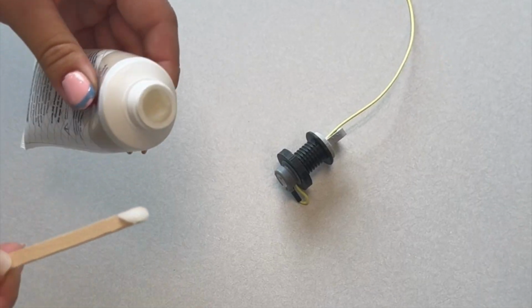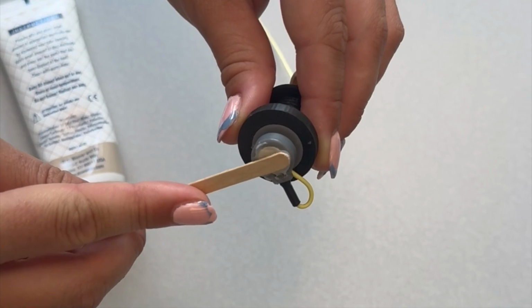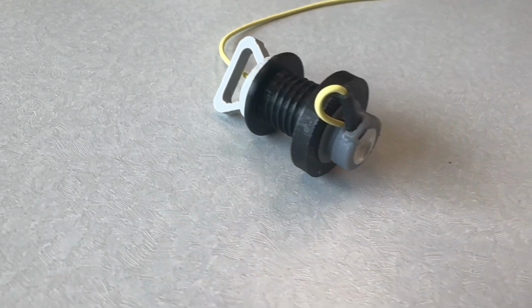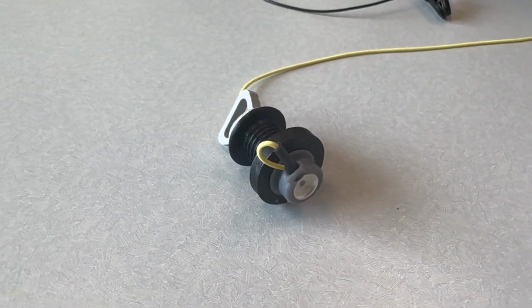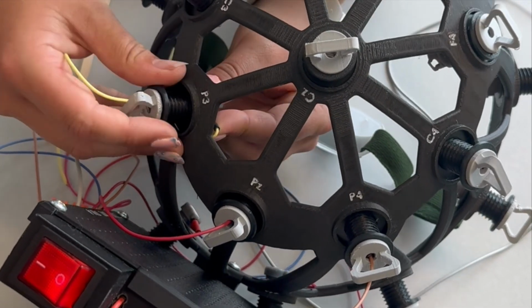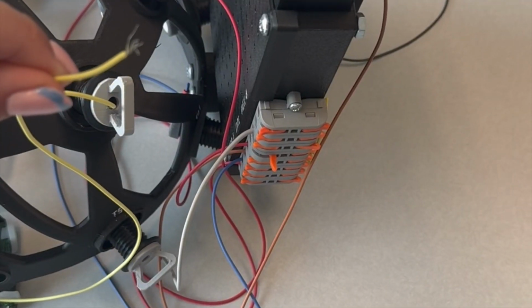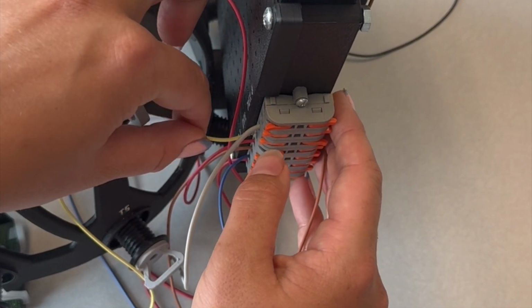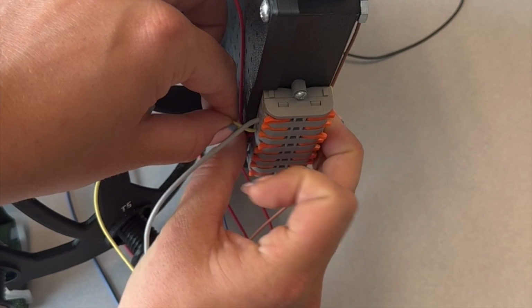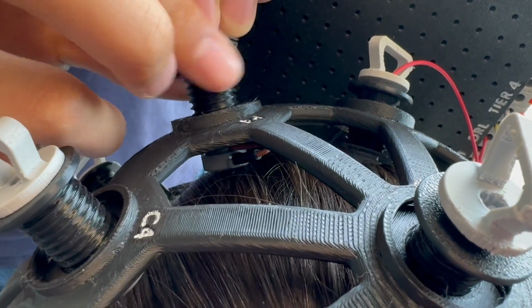To prepare the EEG system, conductive electrode gel is applied to each electrode location to ensure a low impedance connection between the skin and the electrode surface. The electrode holders are interchangeable and can be removed and placed at different locations on the enclosure, allowing for full configurability based on the study design. Each holder is also individually adjustable to maintain consistent contact at every placement location.